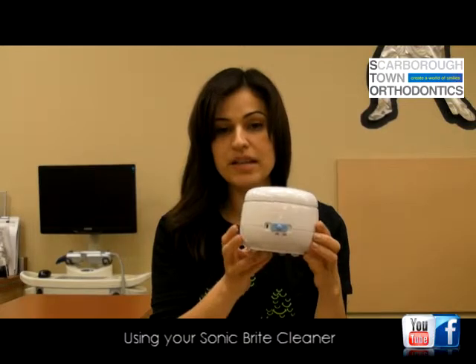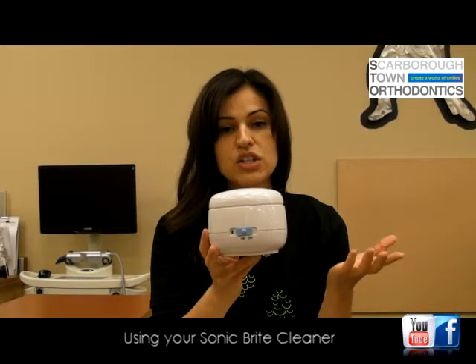Now you only need to leave your aligners in the unit for a few minutes, and the unit will automatically shut off after 15 in case you forget your aligners inside. Once you're done cleaning your aligners, remove them from the solution, give them a really good rinse, and you can put them back in your mouth.